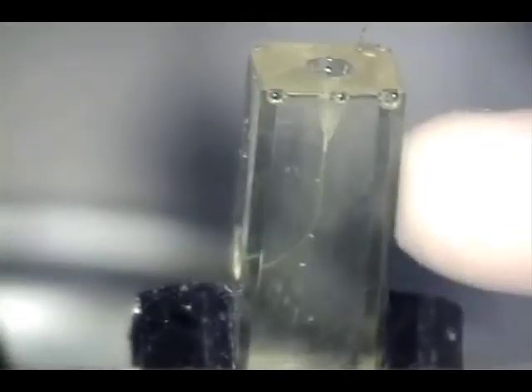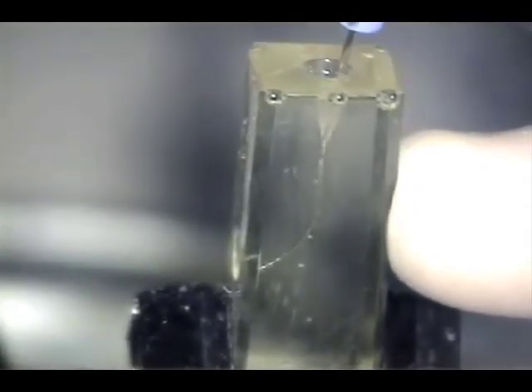The 10 reamer is then placed in the reciprocating handpiece. So far, so good.